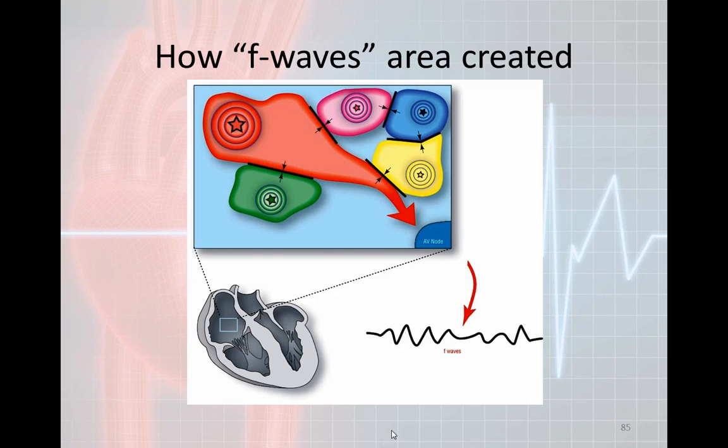So in this case, you do have all of these little depolarizations here, which gives you the lowercase f waves that you can see on the monitor down here. And what happens is eventually one of these makes it through and will give you some type of QRS before you go back into this stuff right here. Now what these fib waves also show you is that the atrial rate is quite chaotic. So there is no real baseline, but there are very chaotic atria occurring right now.